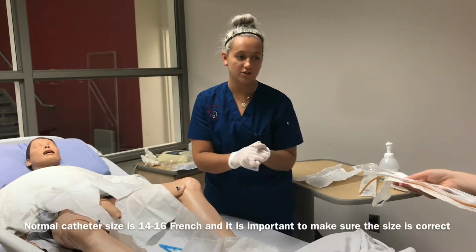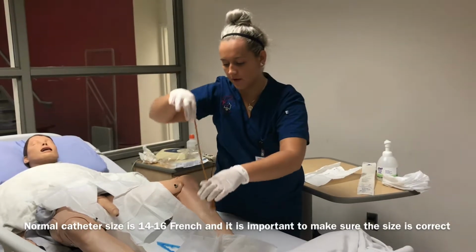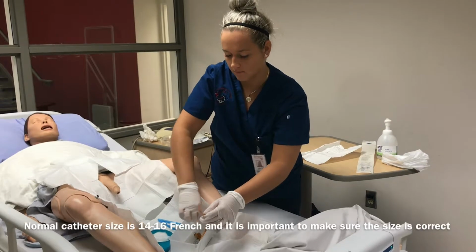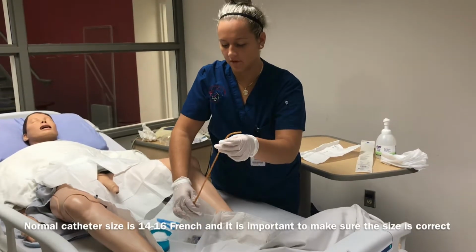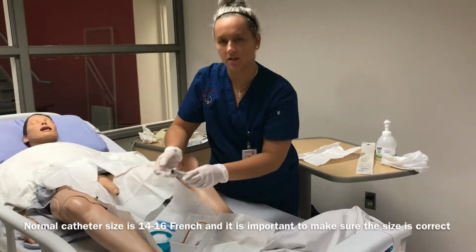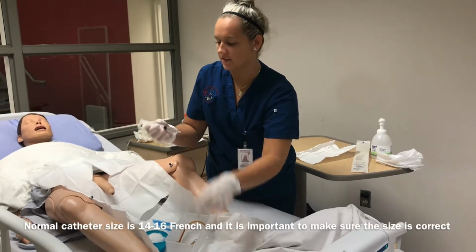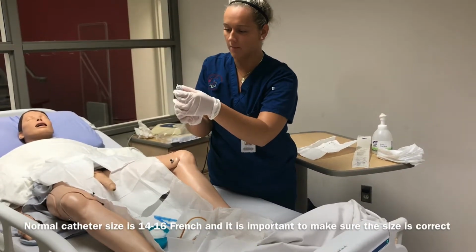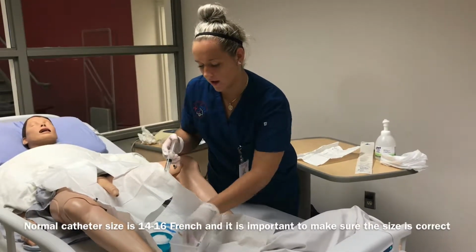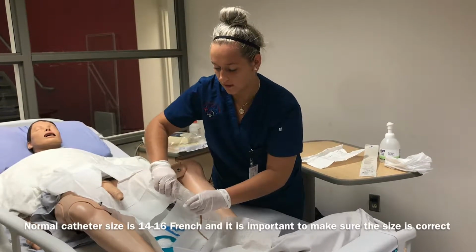Okay, so now someone is just assisting me to open the catheter. So I'm going to take the catheter and put it in here. And in order to make sure the catheter works, you're going to want to insert the solution to make sure that the balloon inflates. So you always want to see how much solution is in before, so it's 10 milliliters of saline solution, and then you're going to want to insert it in here.